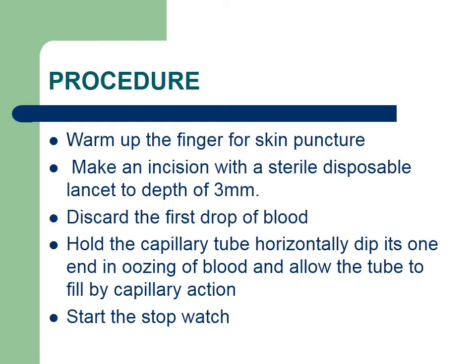Let's start the procedure. First, introduce yourself to your patient, take consent, and briefly explain the procedure. Then clean the fingertip with an alcohol swab and make a sharp incision of 3 mm with the disposable lancet. Discard the first drop of blood, then hold the capillary tube horizontally and dip one end into the oozing blood. Allow the tube to fill by capillary action, then start the stopwatch.